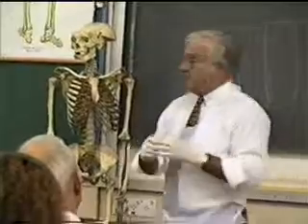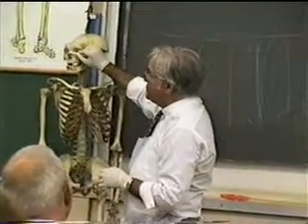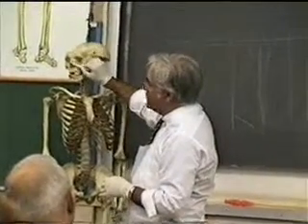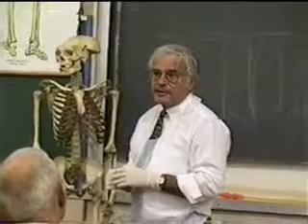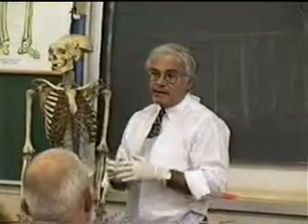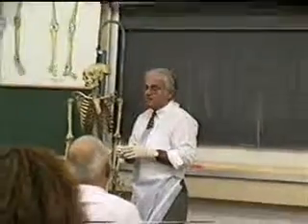In other words, you can push it in lower because you've got space, but it'll come out a little bit up above, and that's called a rocker. So you don't want to do that. Your osteotomy, if you do a medial osteotomy, you can do this in the lab too, should go towards the inner canthus, just slightly up to this process, and really join with the lateral to complete a complete transfixion, a complete osteotomy of the bones, so that it's okay.